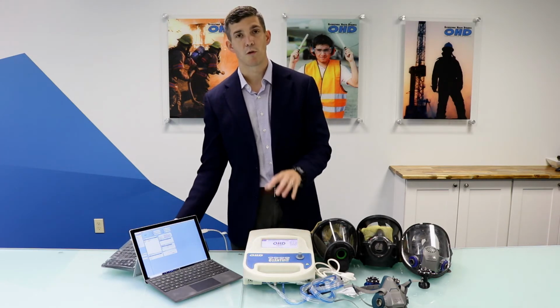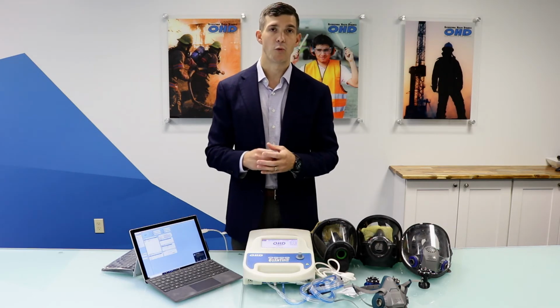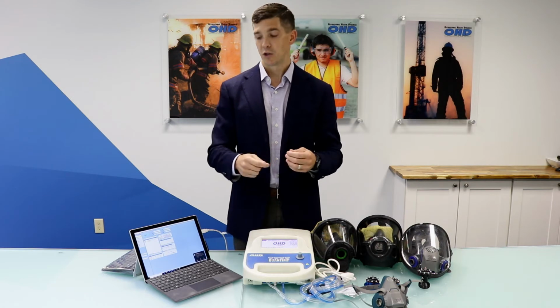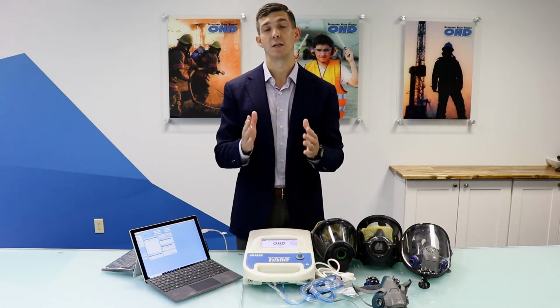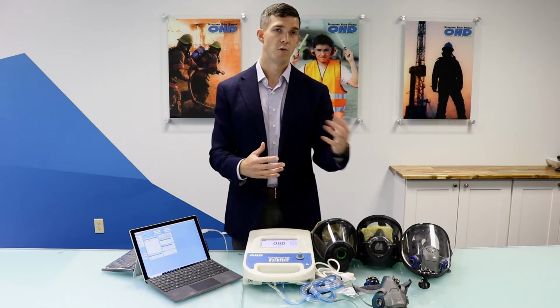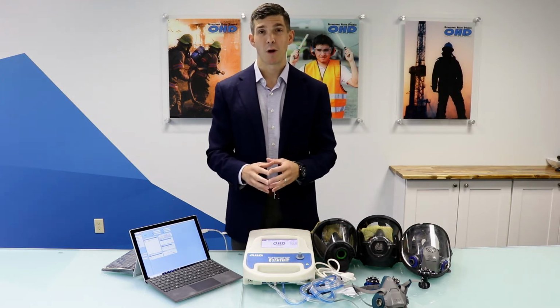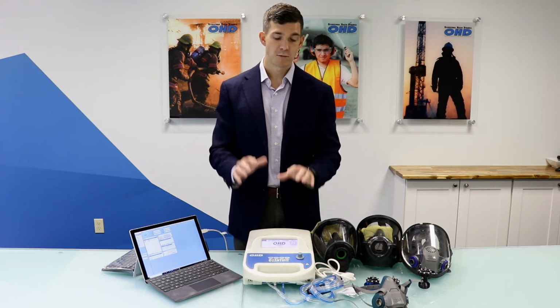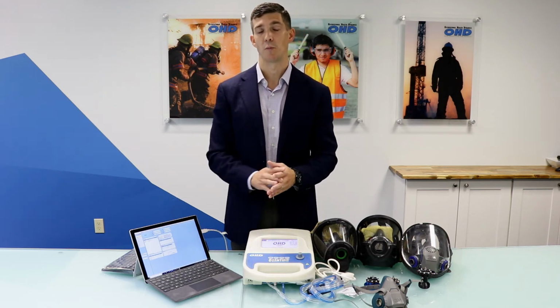The system will store 500 fit tests on board. Those can be exported off to a USB thumb drive, straight into your software later if you'd like to do that. But keep in mind that it's a limited number of people. So when you get to 500, it begins to overwrite the original records that were on that. So that's why it's probably the least used method of doing fit testing. Still a great way to do it if you want to take it and do it standalone and you don't have access to a computer.